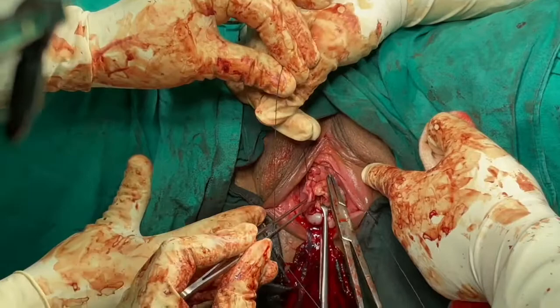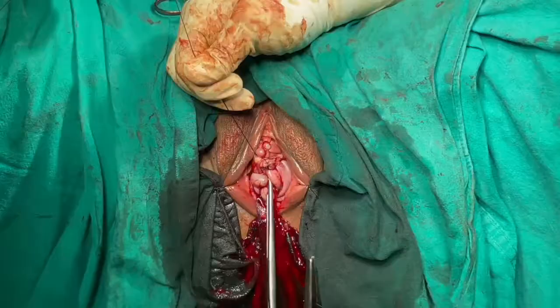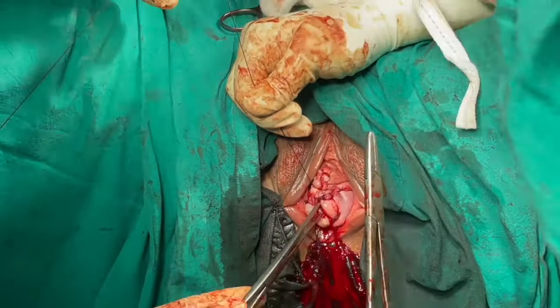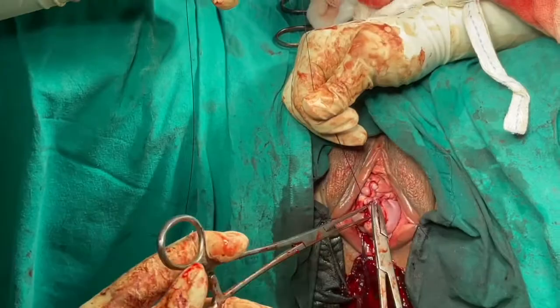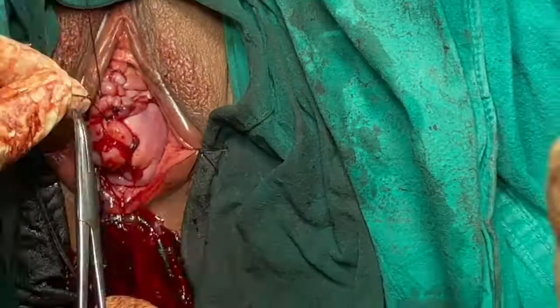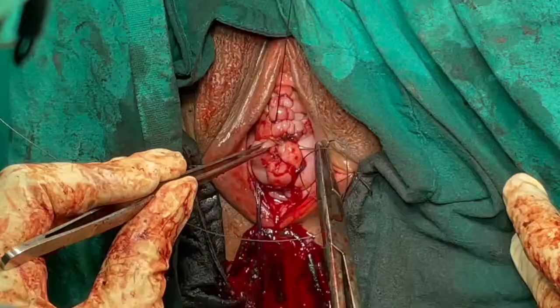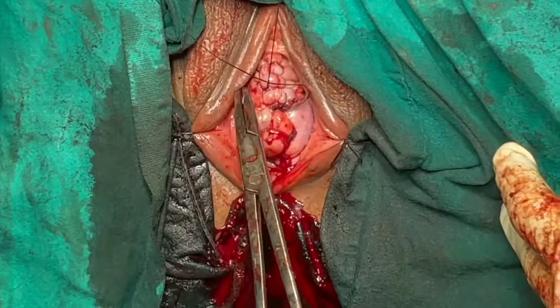Remember, there is no need to remove the redundant vaginal tissue in this case because the inverted V-shaped vaginal tissue has already been removed at the beginning of the case. It is very important that when closing the anterior vagina, the anterior lip of the new cervix should be held with the Allis clamp and the vaginal mucosa should be firmly tied to the bare anterior cervix. Make sure that the cervical canal is not obstructed at any time. Once the sutures are firmly passed through the vagina and through the cervix, the remaining unsutured portion of the anterior vagina can be closed and the suture ended.